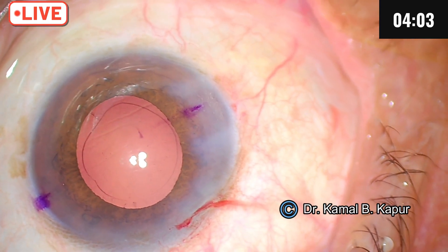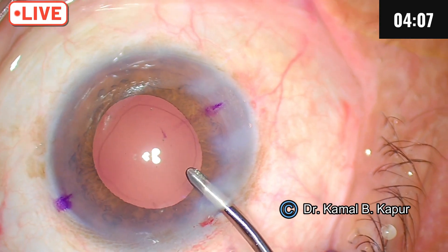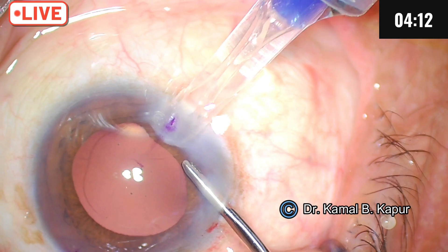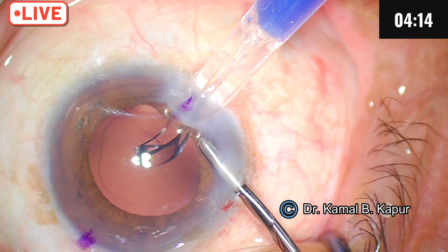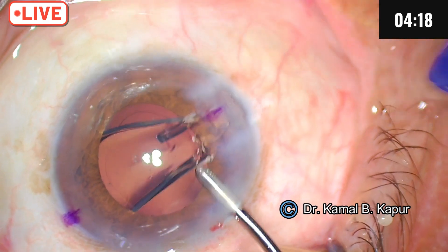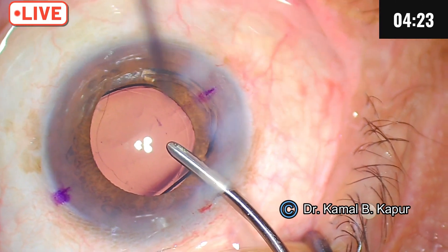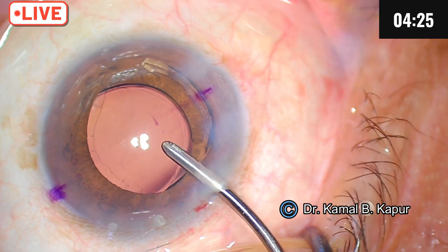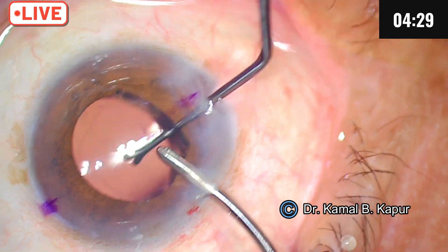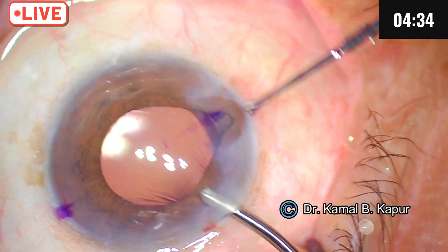Now we will implant the lens. Using a new keratome 2.8. The lens is inside. I will not be using the previous keratome because I think it was a little blunt — I had to use a lot of force with that keratome. Now we will simply load the lens inside.